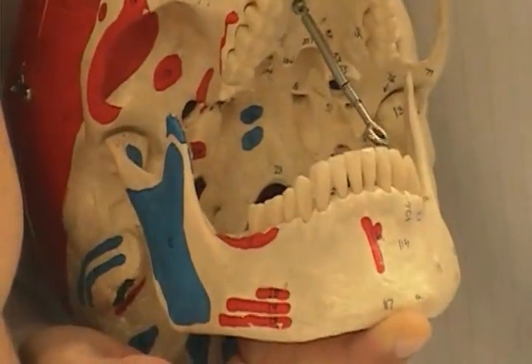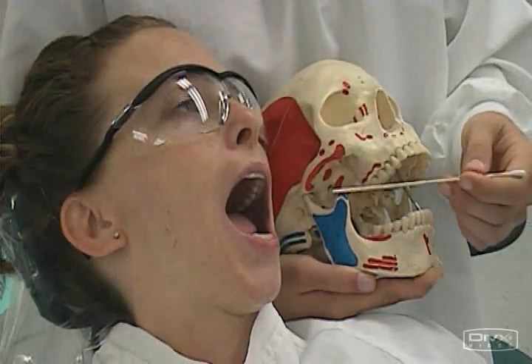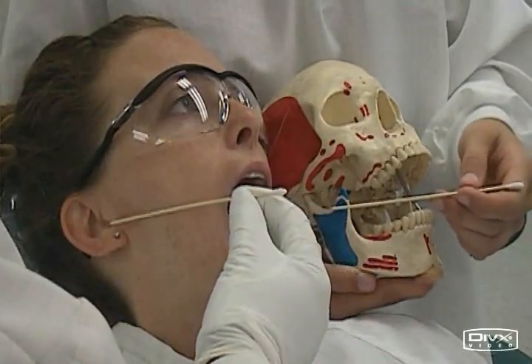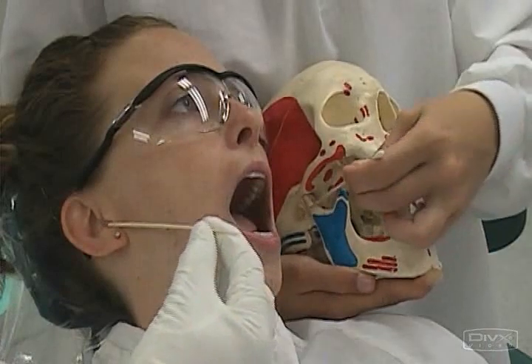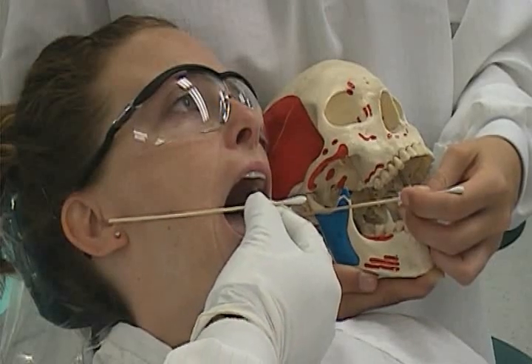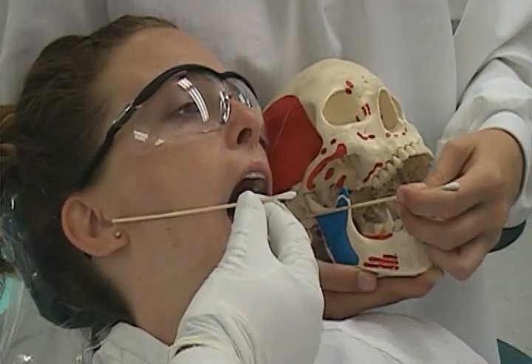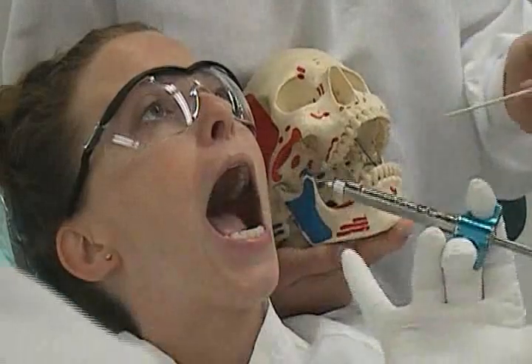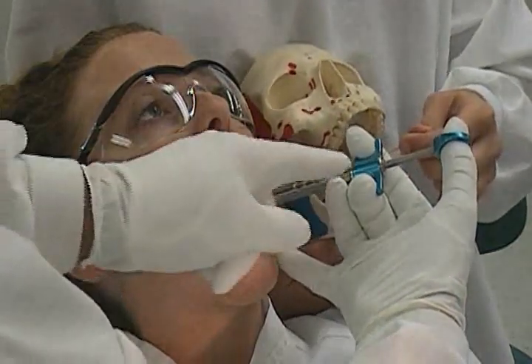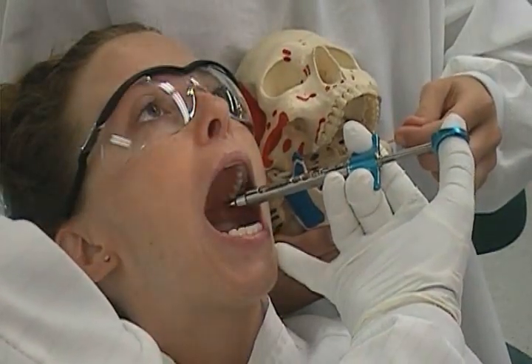Our technique today will be using a 25 gauge long needle. This requires that the needle be aligned with the lower border of the tragus. The correct landmark is the center of the external auditory meatus. Align the needle with the plane extending from the corner of the mouth to the intertragic notch on the side of injection. It should be parallel with the angle between the ear and the face. Direct the syringe towards the target area on the tragus.